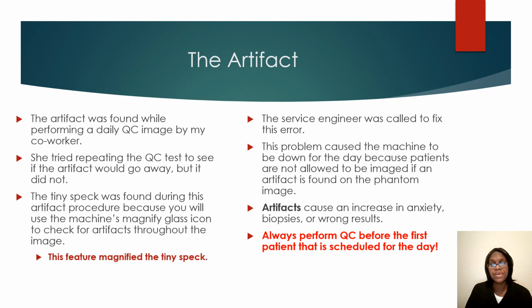Whenever the artifact was found, a service engineer was called, but this did close down that machine for the day. Whether it took 2 hours or 6 hours to fix, we couldn't take any images, because what if this was seen in a patient's image? Now they have to come back, maybe have a biopsy or more images. Now they're worried. And what if we didn't even know it was due to an artifact? If it happens on multiple patients, now you're calling multiple patients back for these types of exams.